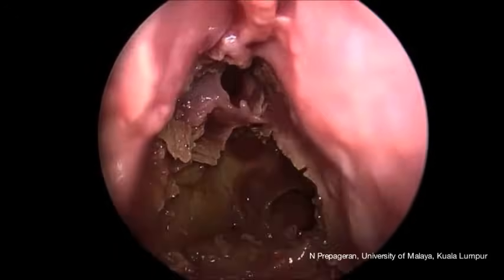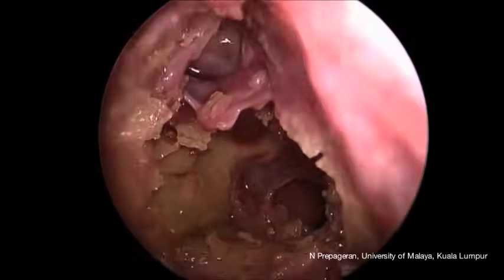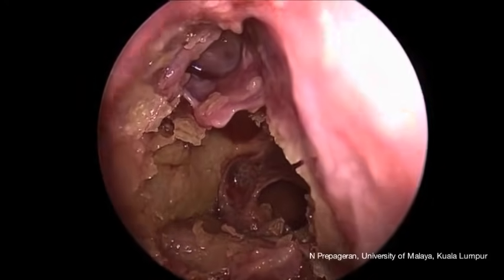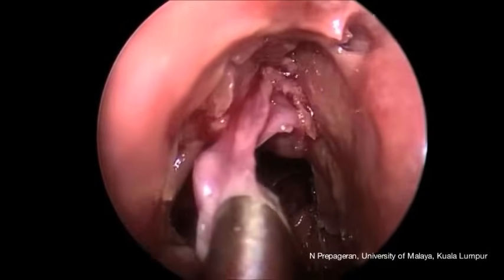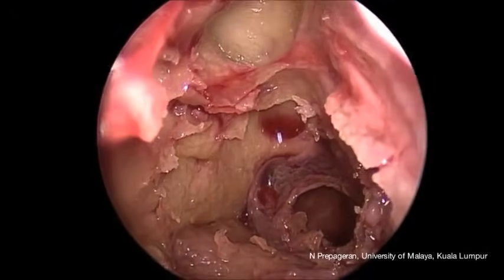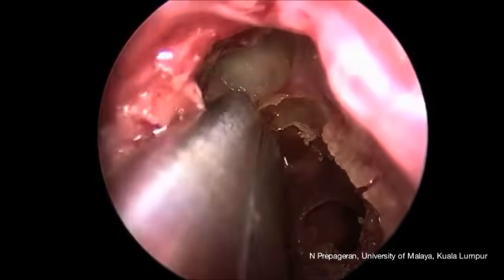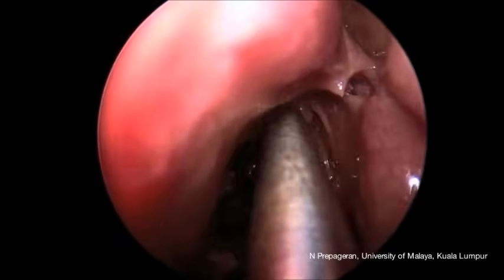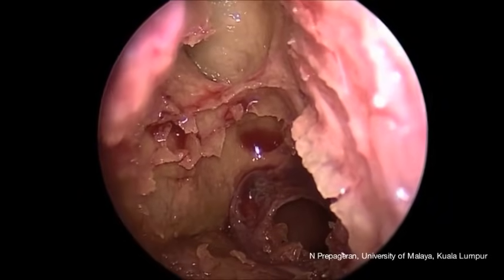Up here we actually have a view of the frontal sinus and possibly the anterior ethmoid artery. You can have a very nice view of the frontal sinus ostia — just clean up a little bit more. How do we know we have the frontal sinus? You can see the bulge of the posterior wall of the frontal sinus — when you see that bulge you know that is the frontal sinus, and it can be very nicely opened once you follow the landmarks. For the sake of dissection I'm going to remove the mucosa over the skull base to identify and visualize the anterior ethmoid artery. There is a very nice view of the anterior ethmoid artery, the frontal recess, and the posterior wall of the frontal sinus, which always bulges out like a tummy from the frontal lobe.